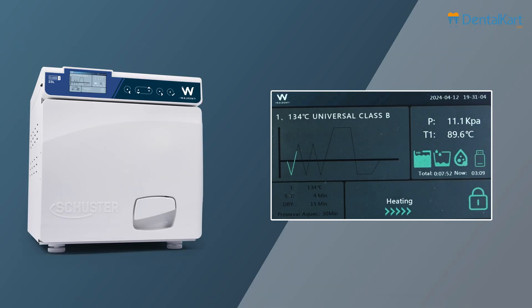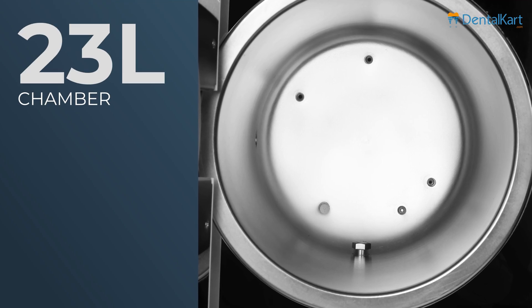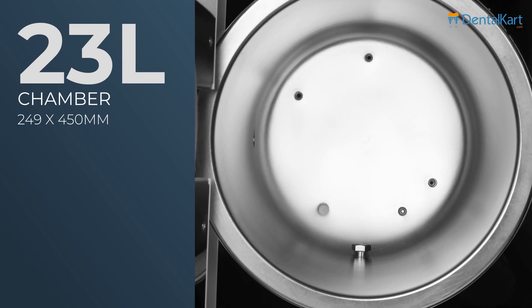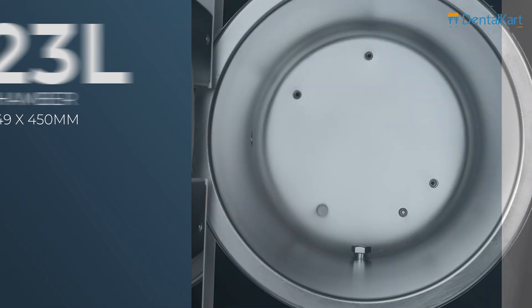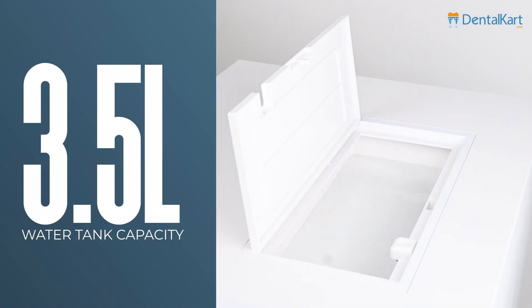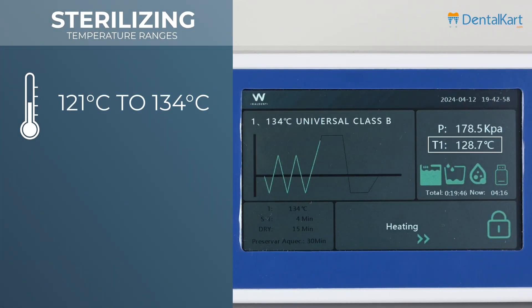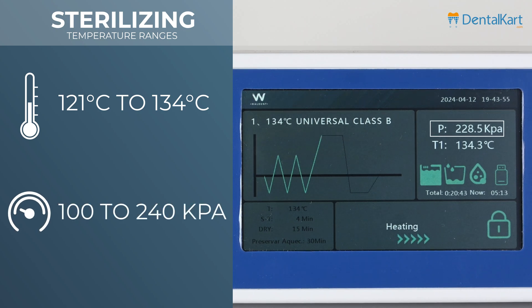The sterilizer's computerized system offers real-time data display during the sterilization cycle, ensuring accurate and reliable results. It has a 23 liters chamber with inner dimensions of 249 x 450 mm, a clean water tank capacity of 3.5 liters, sterilization temperature ranging from 121°C to 134°C, and sterilization pressure ranging from 100 to 240 kPa.